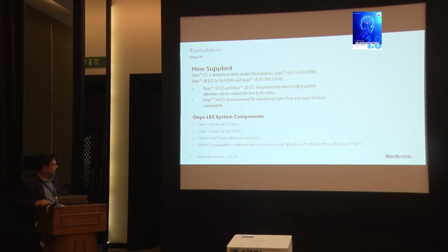So the ONYX itself is supplied in these components. You have one vial of ONYX, you have one vial of DMSO, and along with that, you are supplied with 3 1 ml syringes so that you can mix and inject.